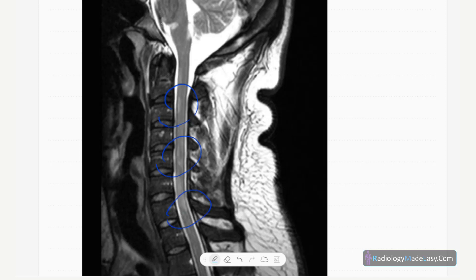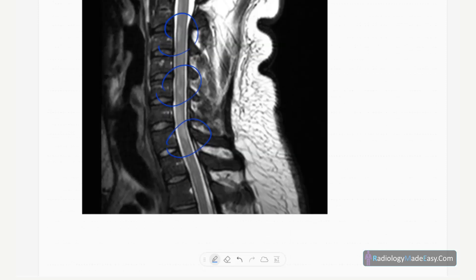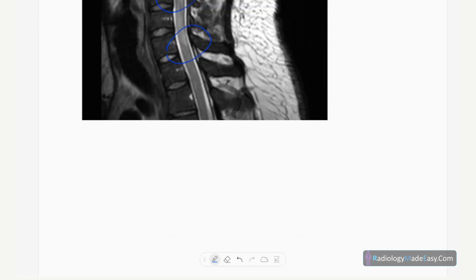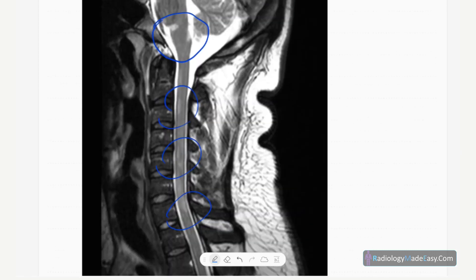This is an example of spinal cord involvement in multiple sclerosis. There are medulla oblongata lesions as well. The lesion length is less than two vertebral segments. These sagittal images show high signal plaques in the spine. In ADEM and NMO, lesions are large and extend more than two vertebral segments — that is one key difference between NMO/ADEM and MS.